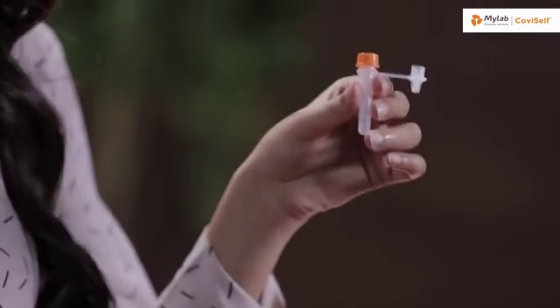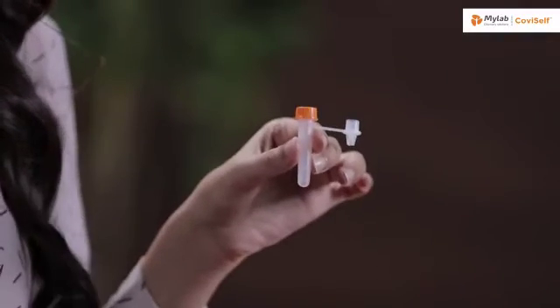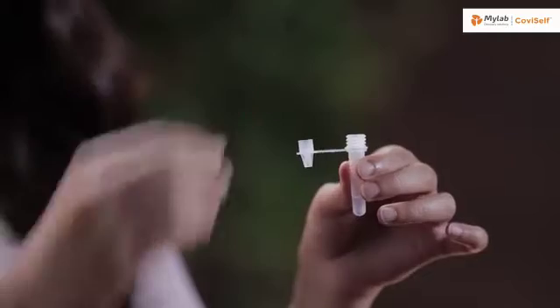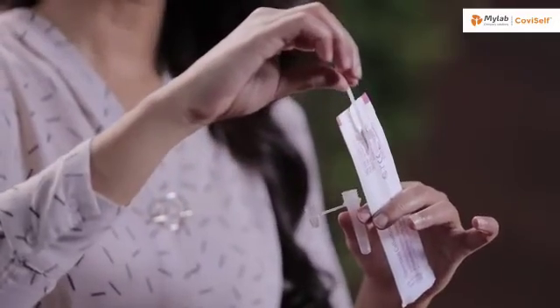Take the pre-filled extraction tube and tap it gently 3 or 4 times to ensure that the liquid settles at the bottom. Unscrew the cap and hold the tube in your hand. Open the sterile nasal swab while holding the tube in your hand. Tear it from the tail end. It's important that you do not touch the swab head.